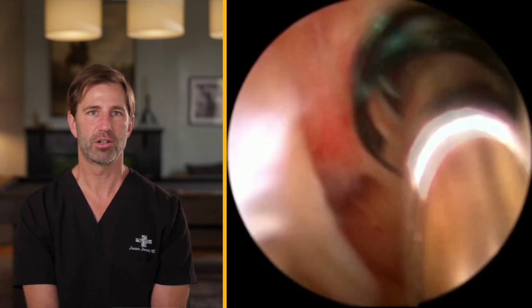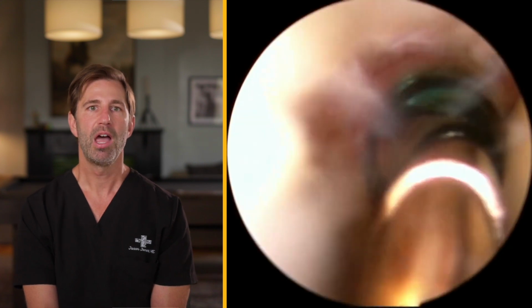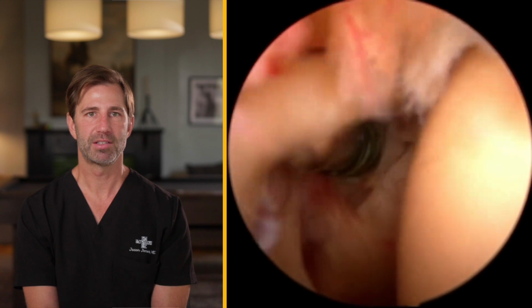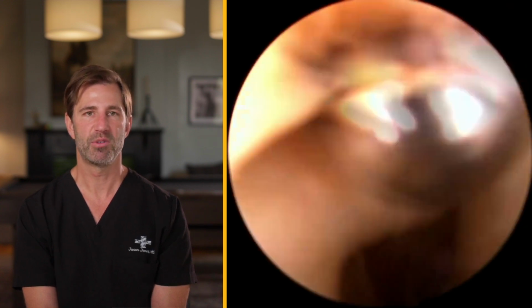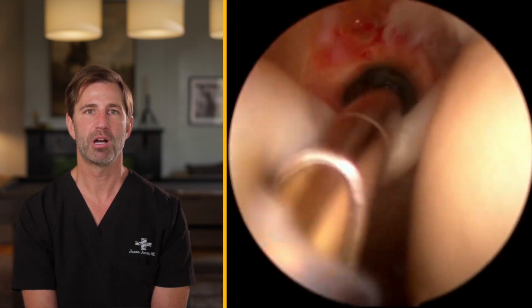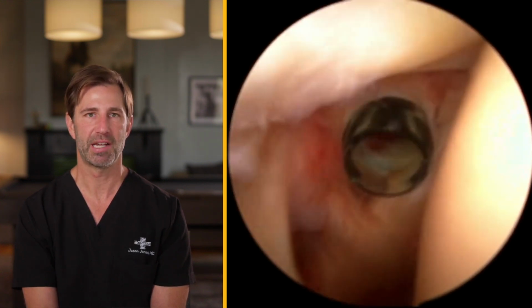Typically, when I do a rotator cuff repair, I do see some damage to the labrum, as we see here. With the use of a shaver, which is the metal device that I've inserted in the front, I'm able to remove the damaged portion of the labrum to remove any portions that may be causing the patient pain and also to stop any propagation of the tearing.